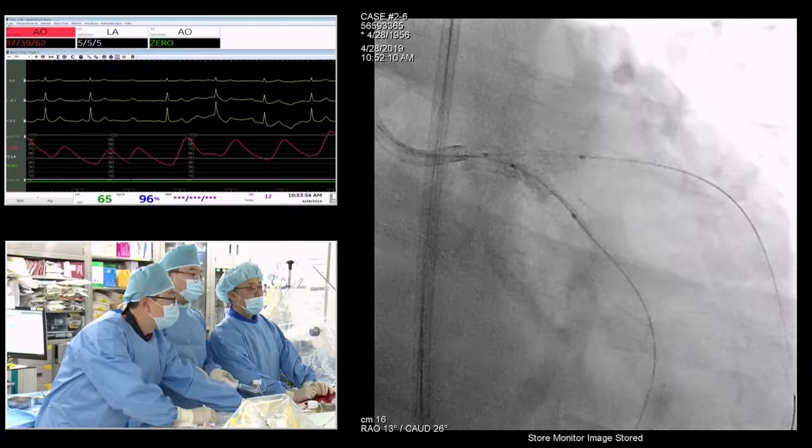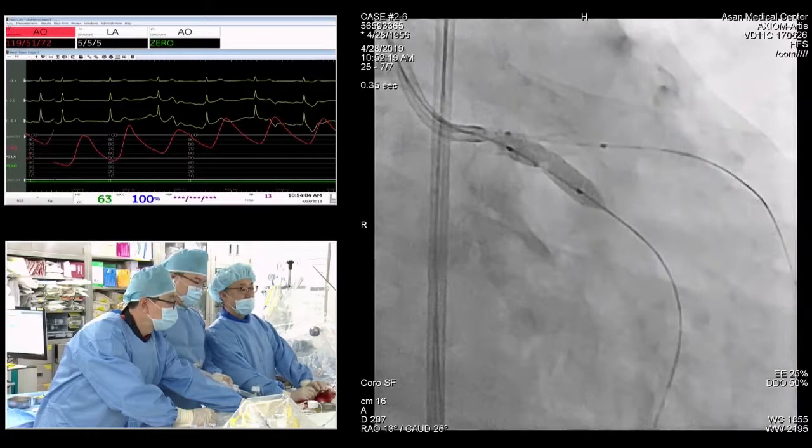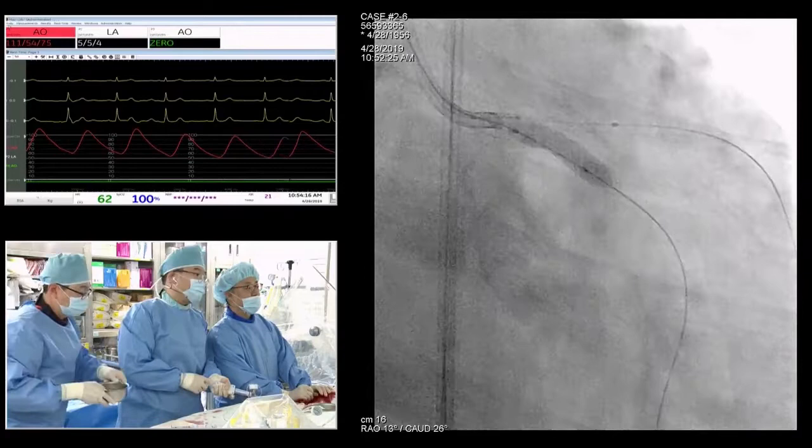12. See the ostium still has a pinch in it. 14. Yeah, give us some pressure. 16. Long duration, high pressure. Okay, got it. 12. Okay, great. 14. It's still a little pinch at the ostial circ.